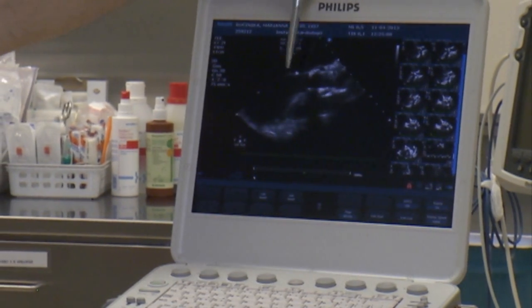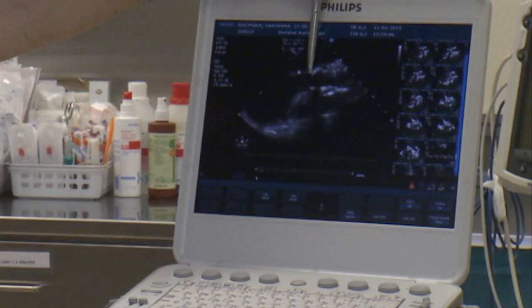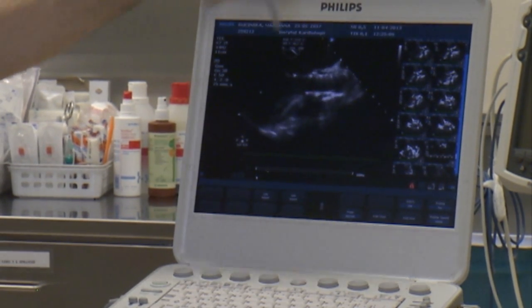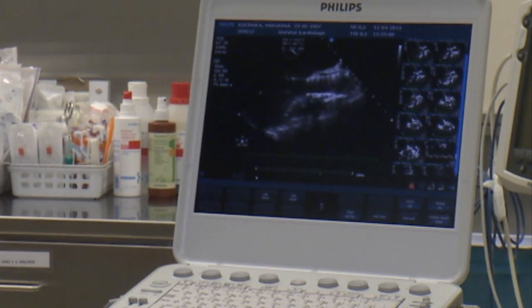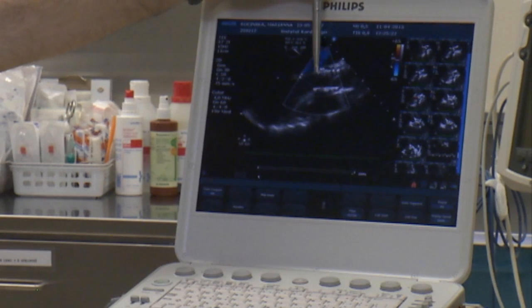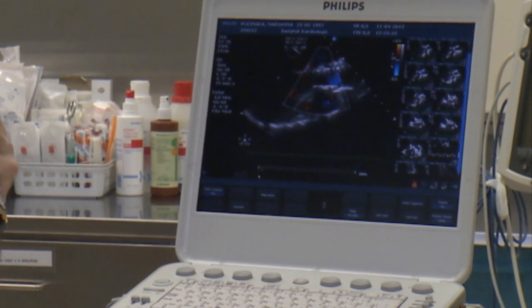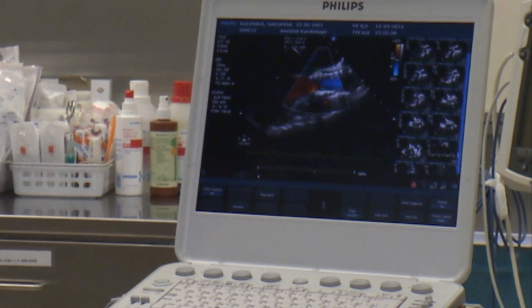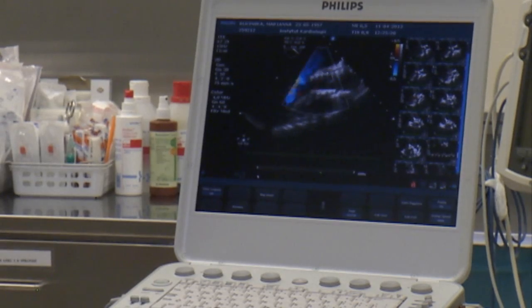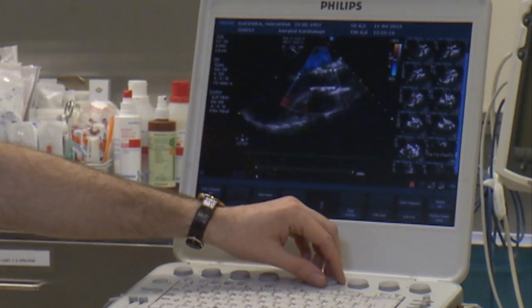The valve now, you can see it's very nicely expanded. It's very nicely located. You can see the leaflets over here. And I would say that the echocardiographic result is perfect. And you can just see a trace aortic regurg paravalvular over here. It's within the scaffolding of the valves. It will probably either diminish or even disappear in a few days, so we shouldn't be worried with that.